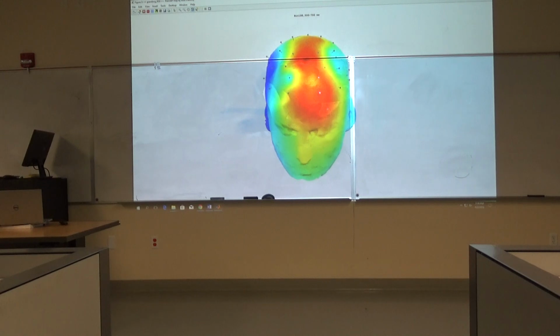Pause that. Oh, I saved it here. Well, you don't need to save the picture, unless you want to. Show your friends, put it on Instagram or something. You can roll around with it and play around with different time points. Go back to your menu settings, change the time points, and see how it changes in the topography.